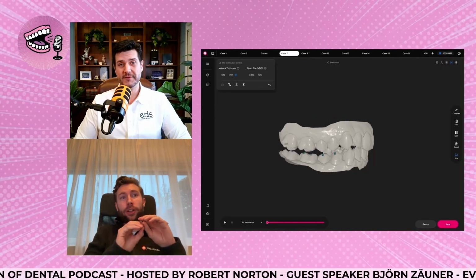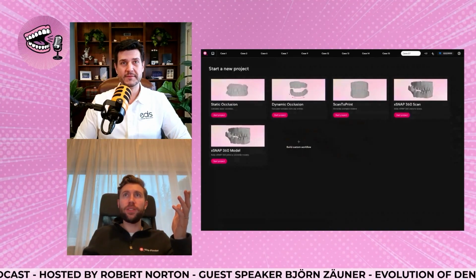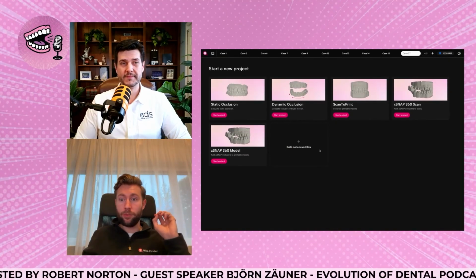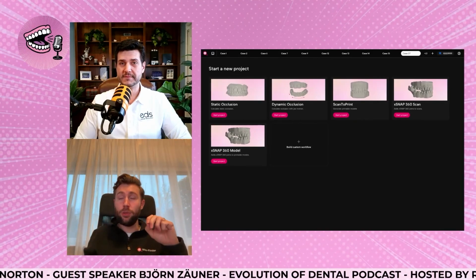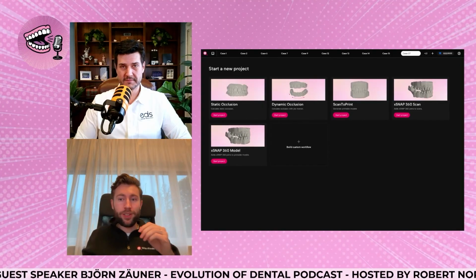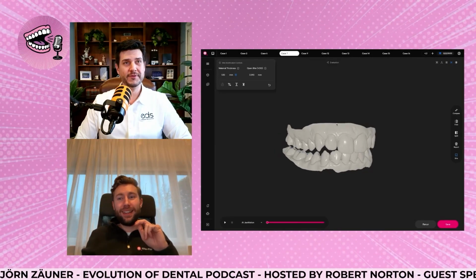Yeah, so we're working on an improved integration with exocad, which we launched at Insights. Now you can save that workflow with a custom workflow. It's called Bite Splint, and what it does is load the case, find MIP, and open it with the parameters you set. In exocad, you already have them in the work params, so you can directly grab them. Pulls that straight in. Yeah, that would be very sweet. Oh, that's so cool.